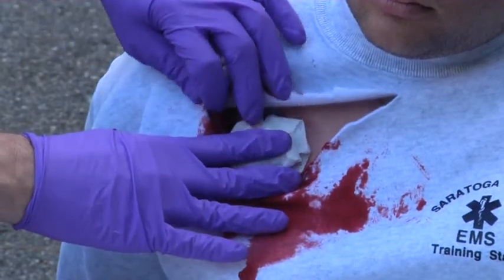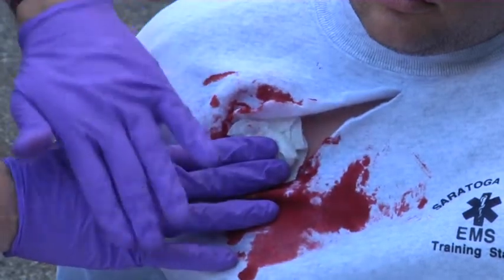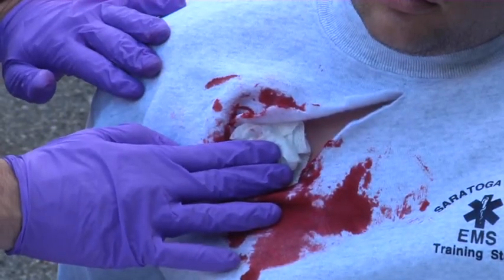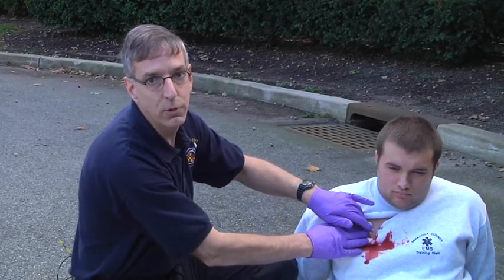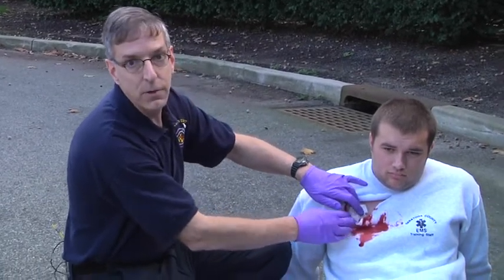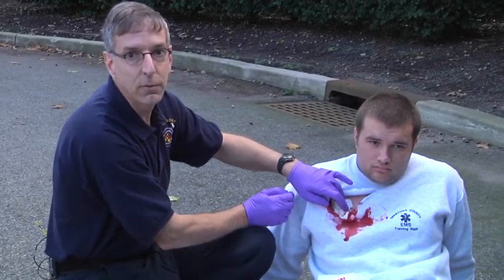In this case, we'd remove the rest of the shirt from the patient around the wound and apply a bandage over the Combat Gauze dressing to tightly keep pressure on top of the surface of the wound, as you would with any other dressing that you apply to a patient. Then, obviously, monitor the patient for signs and symptoms of shock and keep an eye on this to see if the bleeding continues.